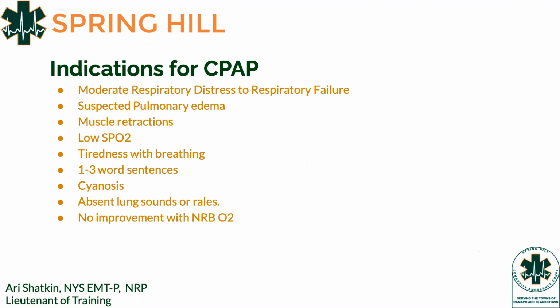If you see a patient having muscle retractions, who knows what muscle retractions are? No. Accessory muscle usage is something else. That's more like nasal flaring or bending over. You see some more muscular action getting involved. Right? That's still a sign of respiratory distress and respiratory failure, but muscle retractions are a little bit different. We were talking about the vacuum hose before, right?